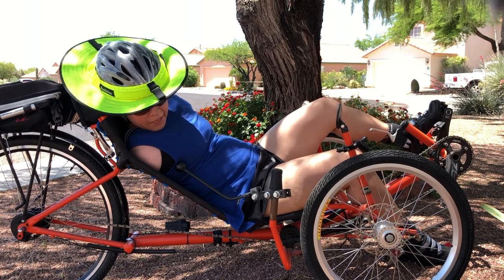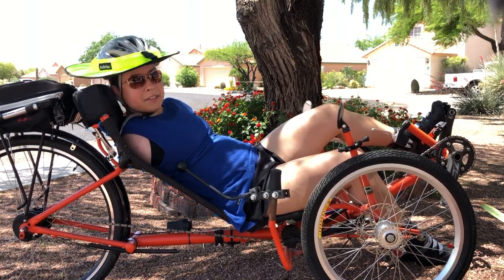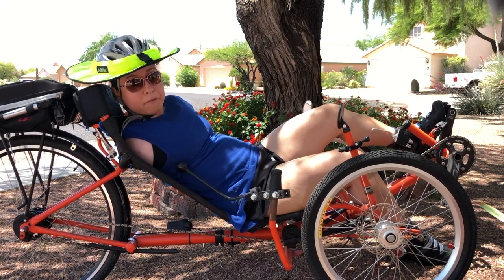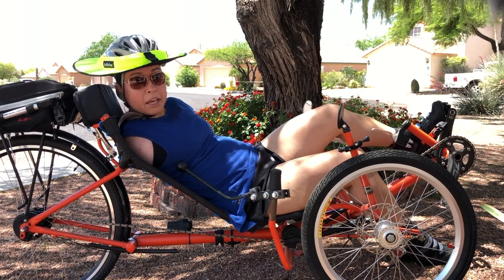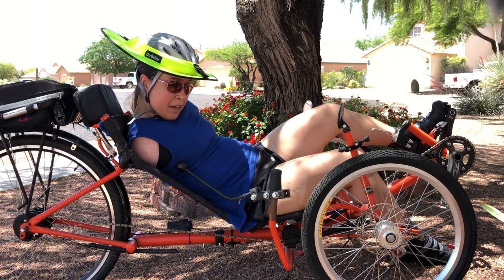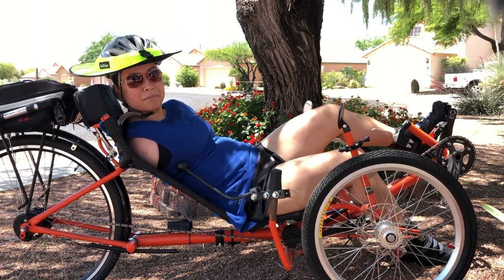I'll let you know how that goes. Up here where my head is resting, this is a headrest that is actually a vanity bag. My father-in-law found this vanity bag and just stuffed it so that I have a place to rest my head when I want to take a break, because having your head up at this angle for a long period of time can really tire out your neck and put strain on it.